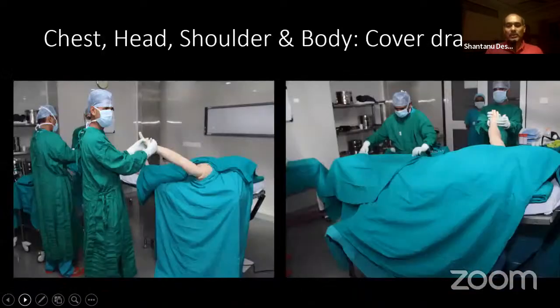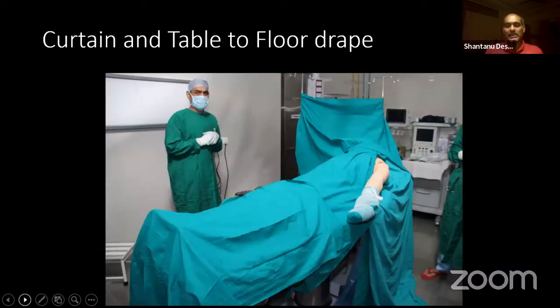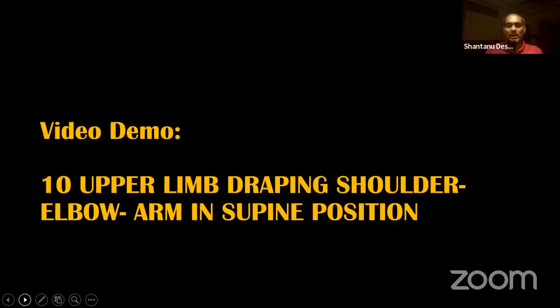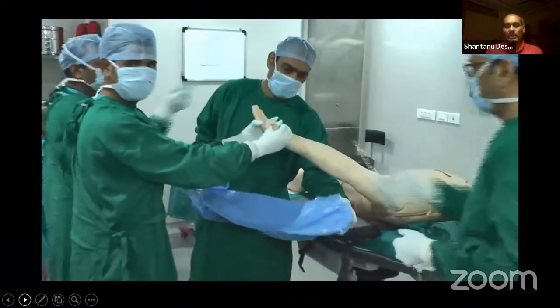So the rest of the body is to be covered. But as we spoke about the groin area, the critical area in the upper limb and shoulder is basically the axilla. So we really want to make sure that the axillary portion doesn't get exposed during the operative work.